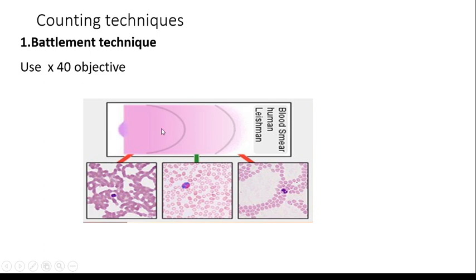Then, counting techniques. Battlement technique. Examine the blood film under the high power objective. Select an area where the red cells are just beginning to overlap. Now, we will see the different parts of the smear.